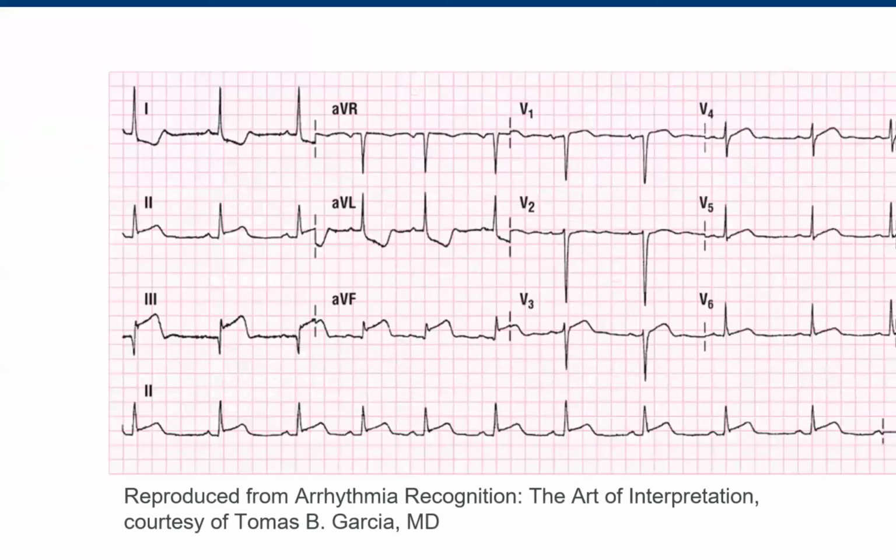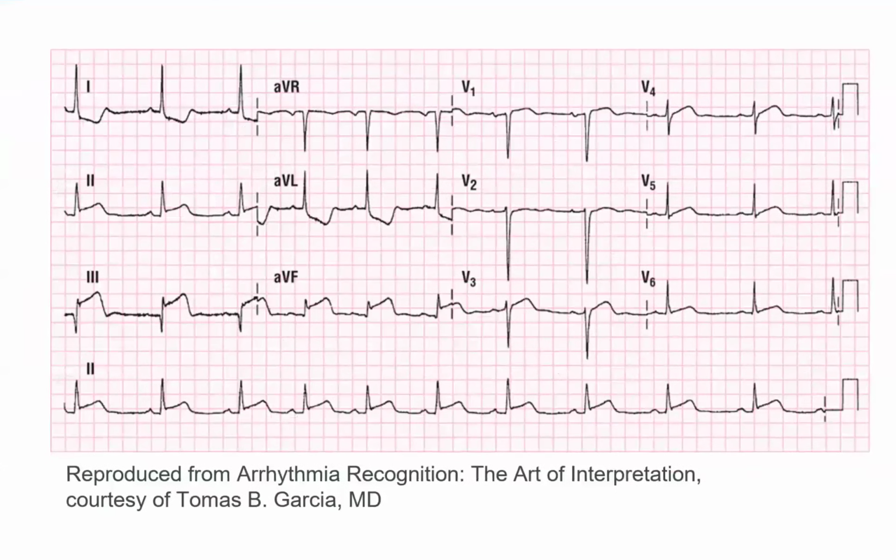All right. First of all, before we do anything else, base rhythm. That's a lead 2, an ongoing lead 2. We love this kind of 12 lead. It's good for us. What is the base rhythm? Do we have P waves? Yes. We have QRSs? Yes. QRS is narrow or wide? Narrow. R to Rs are regular.